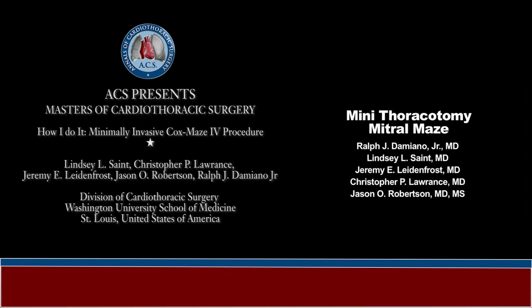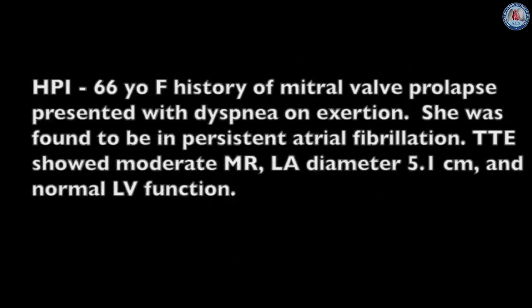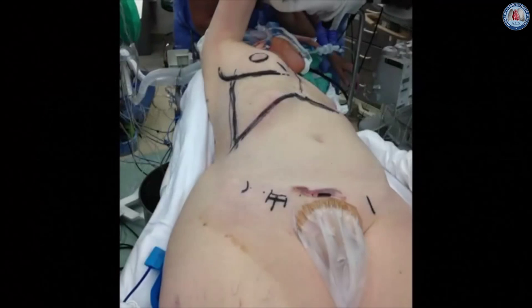This video shows how to perform a mini thoracotomy mitral valve maze procedure. This is a 66-year-old woman with mitral valve prolapse who presented with heart failure.